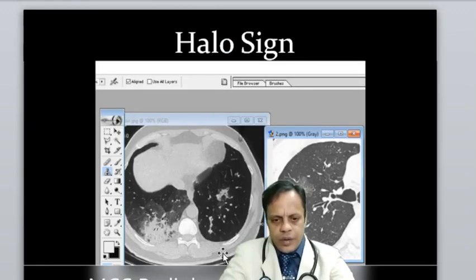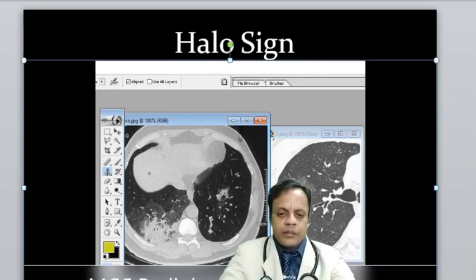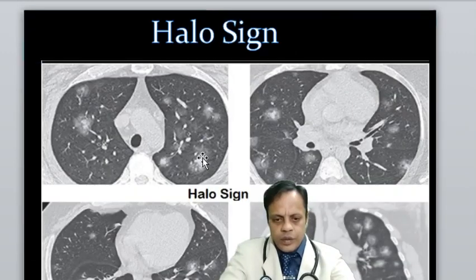So there is one video also. This is the GGO. Okay. So I have taken some more CT scan pictures. I will take a consolidated area and paste it over here. Very simple thing, just to give you a demonstration of photographic memory. I have cloned from here and am just pasting over here. Look carefully. If you look, it will look like this. Okay, so very simple. This is our mode of teaching, how to clear the thing.